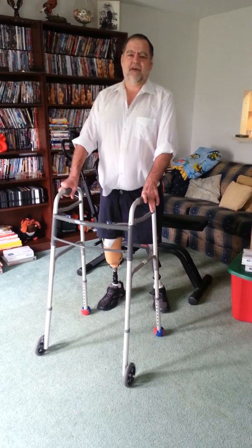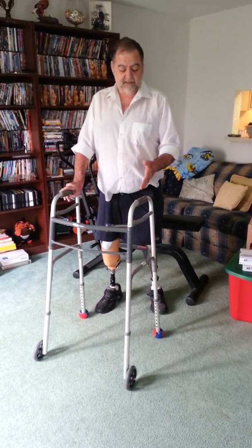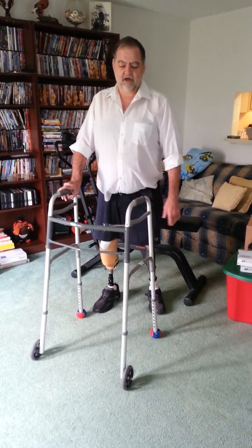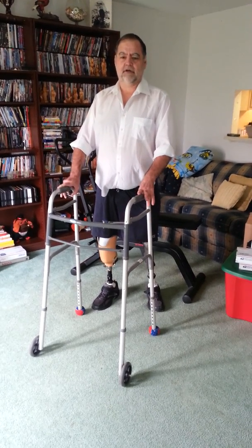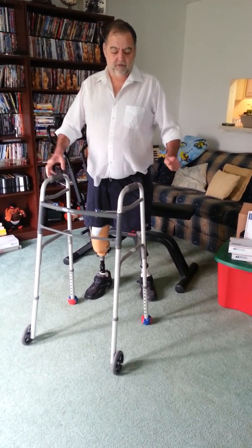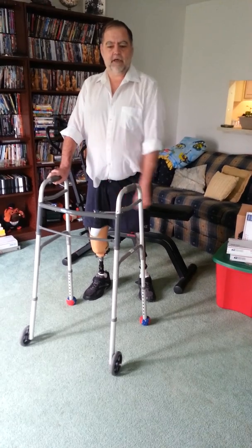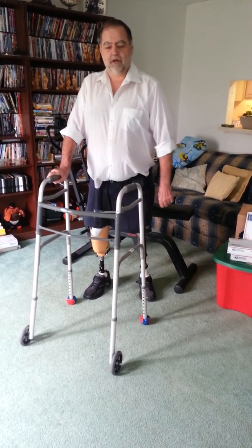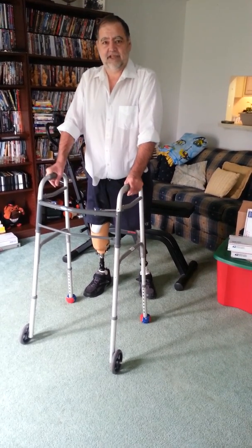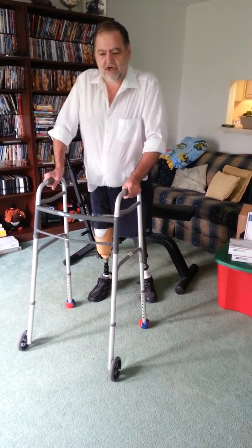So, of course, I was in a little rehab facility for a couple of hours when I was doing this, and they had parallel bars. They didn't have a walker. I don't have parallel bars at home, so I'm going to be using this walker instead to demonstrate. So I'm holding on to the parallel bars, and what this guy did was he drew a cootie, or a big bug, on the floor. He had steps that were about my stride, and he was saying, squash the bug. So it was kind of like heel to toe, but his idea was squash the bug.